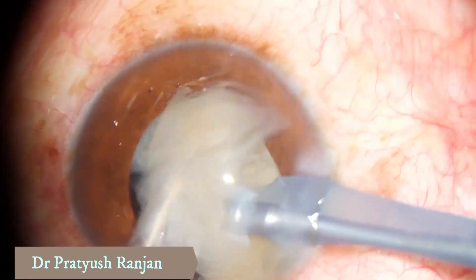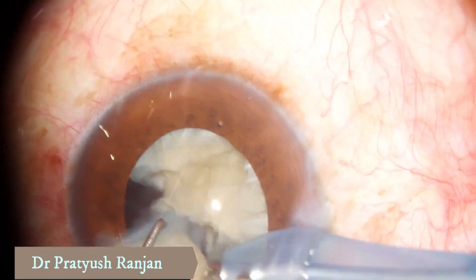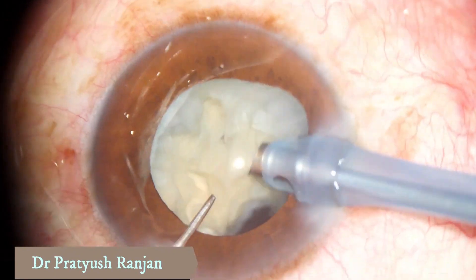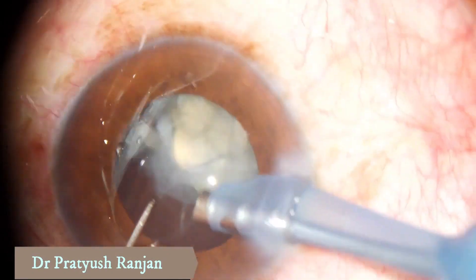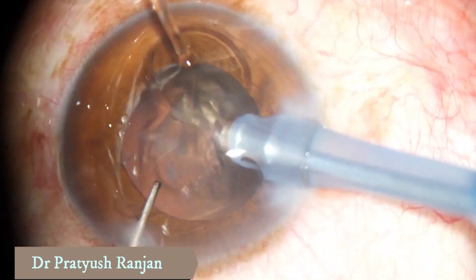Then you push them into the bag again to start the emulsification process, which ideally should take place in the bag. Sometimes it's not possible because the pieces are big and they don't go easily. So that's how a hard white cataract is sculpted and emulsified like this.